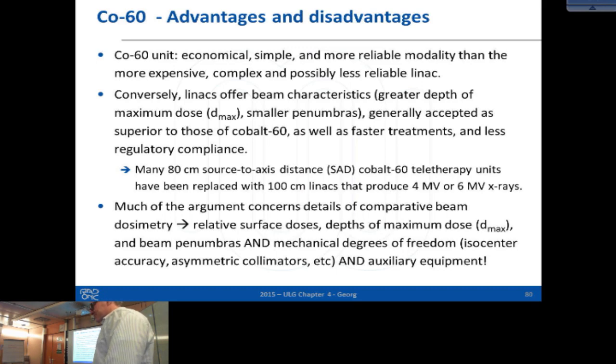You know that? Nowadays, if I take a simple Linac, an Elekta Compact, it's cheaper than a cobalt system. Oh, really? Yes. I didn't know that. But of course, in many of these countries, they're not seeing the same patients like we see. They have more advanced cancer types, larger volumes to be treated, and more in a palliative setting, and then all these fancy therapies that I explained previously don't make sense.